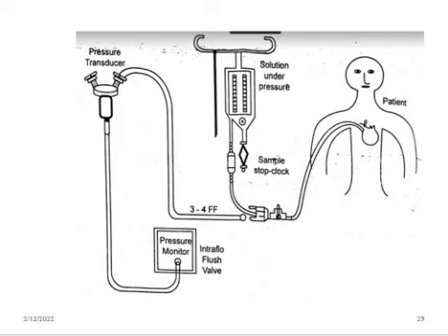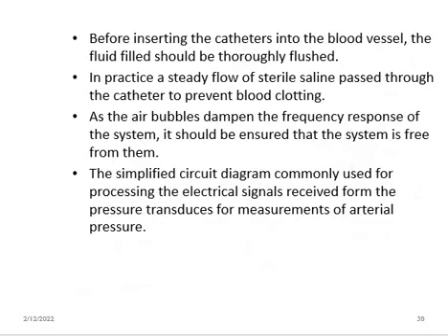Instead, the tip of this tube will have its own transducer that measures the pressure change in the portion where it is kept, and that change is directly converted into electrical signal, which is taken for manipulation. That is the definition.